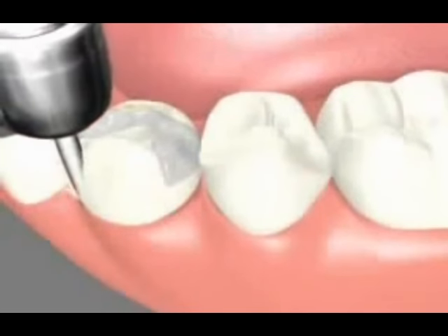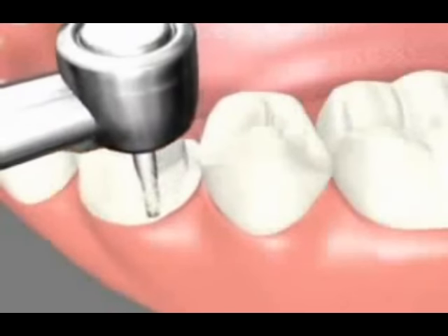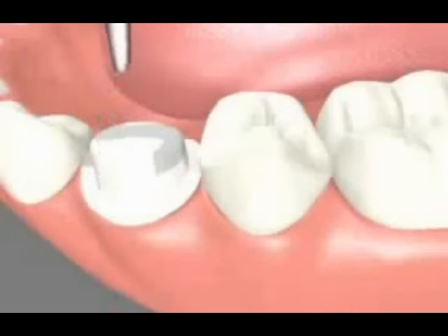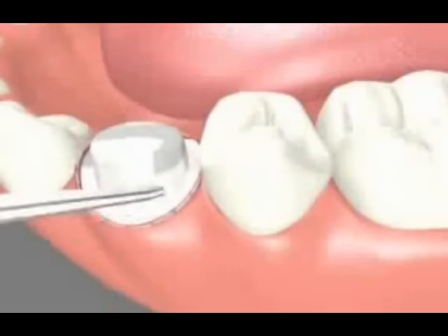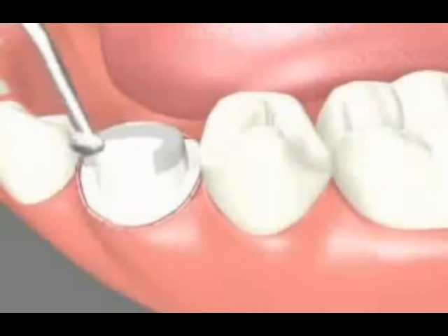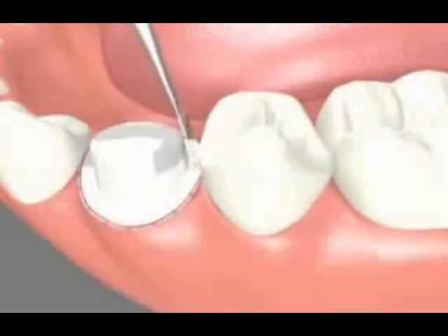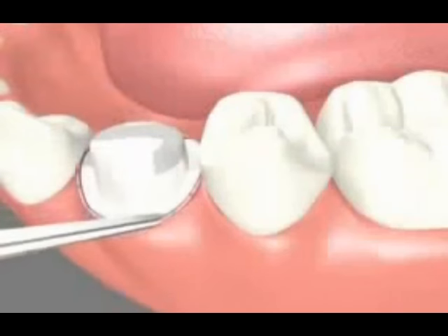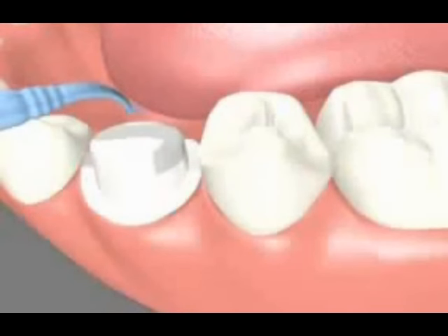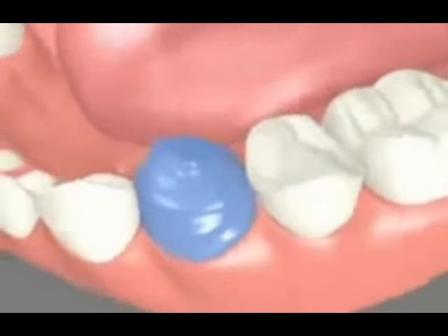The tooth is then prepared for receiving the permanent crown. The placement of a retraction cord helps to obtain an accurate impression. The impression is taken for precise lab fabrication of the crown.